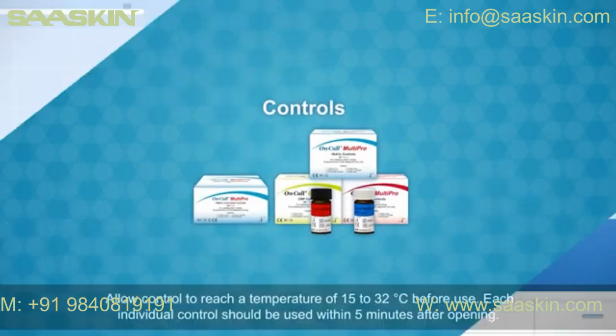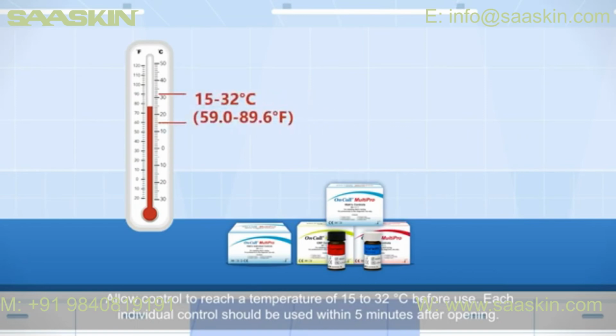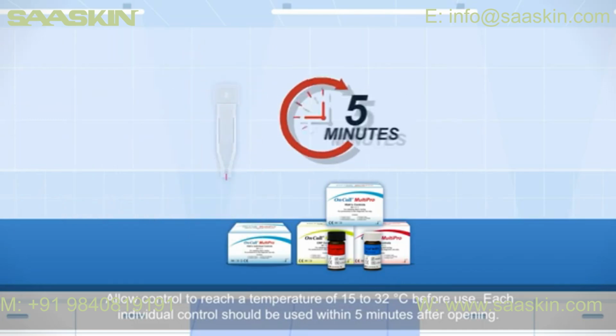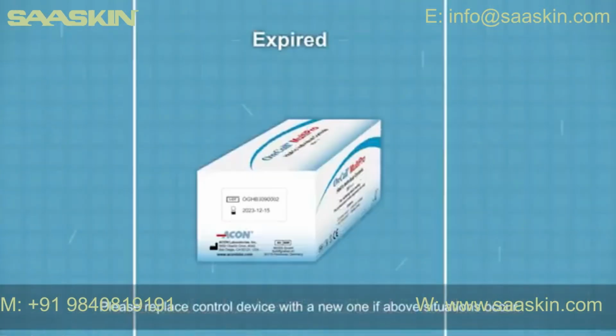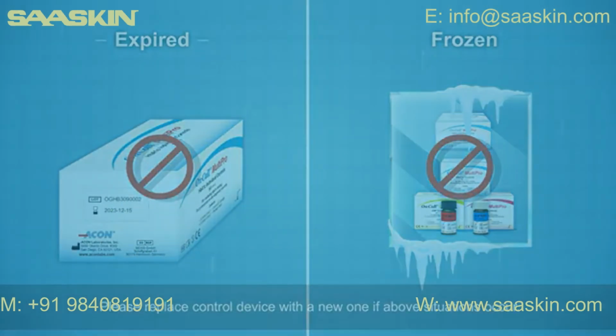Controls. Allow control to reach a temperature of 15 to 32 degrees Celsius before use. Each individual control should be used within 5 minutes after opening. Please replace control device with a new one if above situations occur.